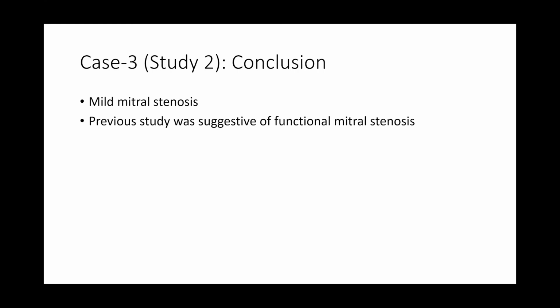If I'm getting a good TTE and my patient is not really sick, then I can wait a little bit, because the tachycardia would have some component and it would not be easy to see; you can slow it down, but definitely planimetry is what I would rely on maximum for my assessment of the severity.